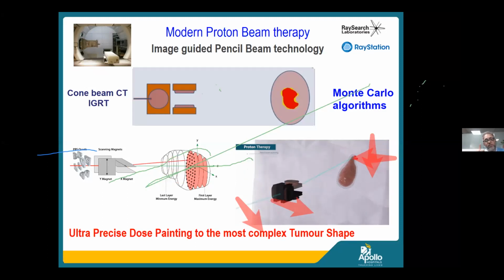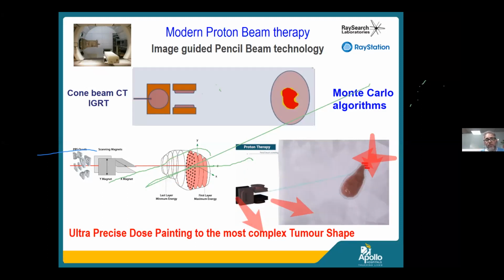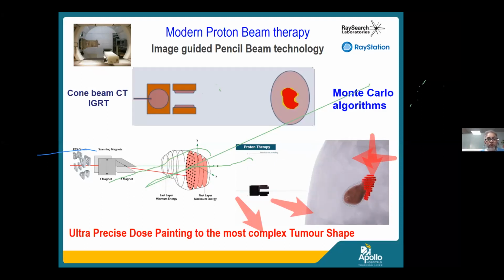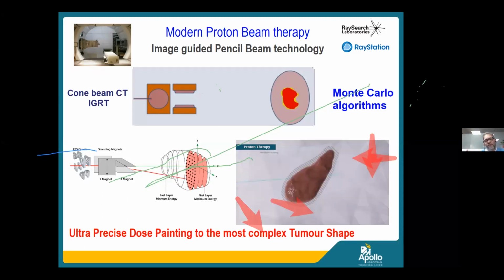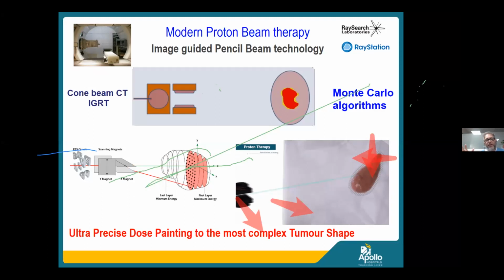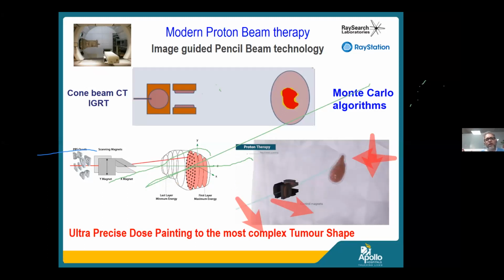So you must realize, you'll be amazed, some of the finest centers in the world, including well-known centers, still do not have image guidance. And finally, two small more things. Many of the proton machines had a limitation of the movement of the gantry. It is a very, very heavy gantry. It weighs about 110 to 120 tons. And if you look at the back of the gantry, it is as tall as about 2 to 3 stories.